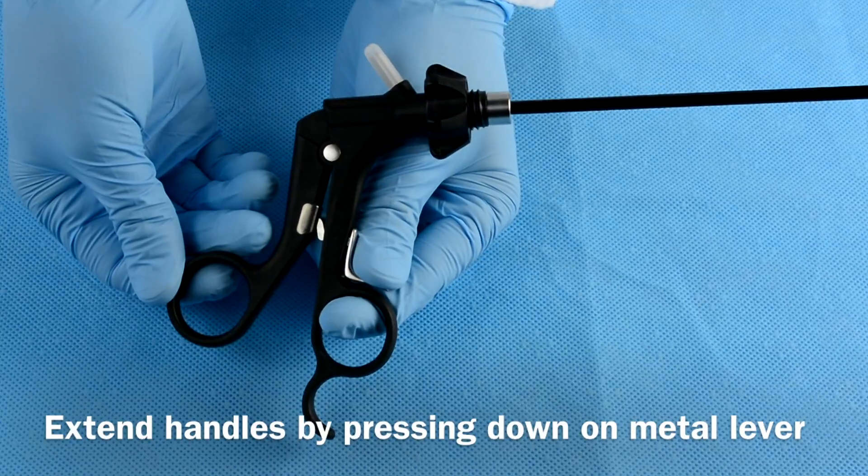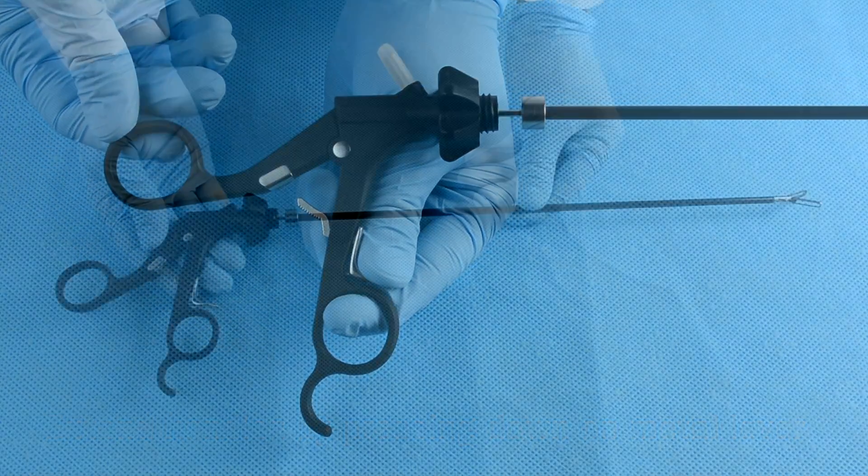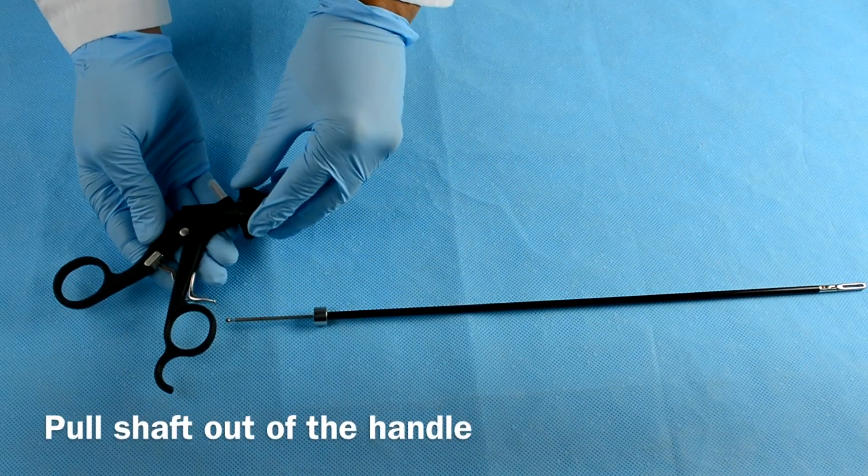Fully extend the handle by pressing down on the metal lever and allowing the handles to come apart. Once the shaft begins to release itself from the handle, pull it up completely.